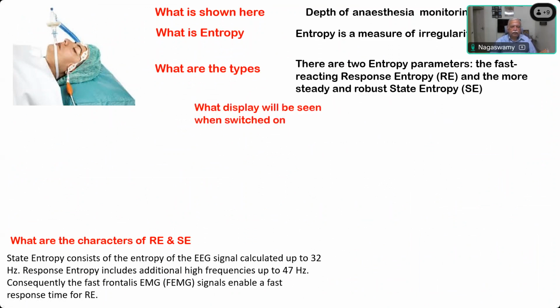What display will be seen when the entropy monitor is switched on? Have you seen an entropy monitor? Yes, sir.